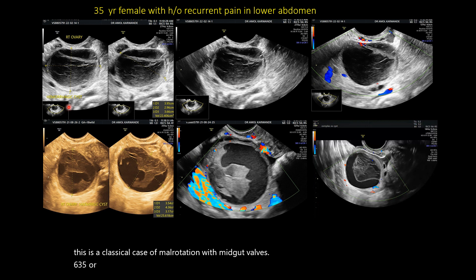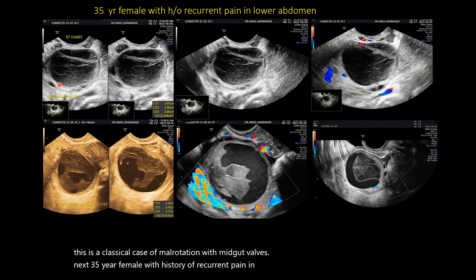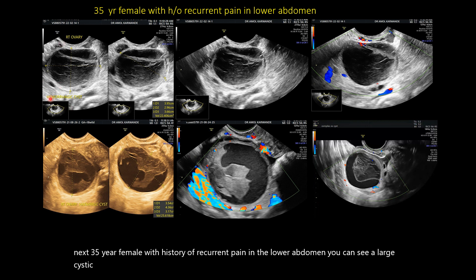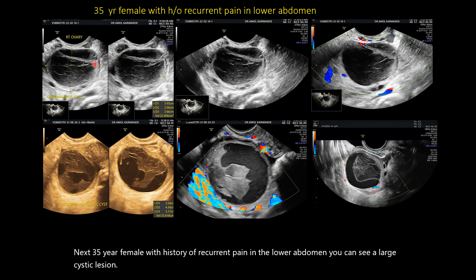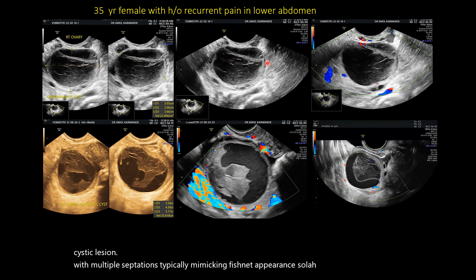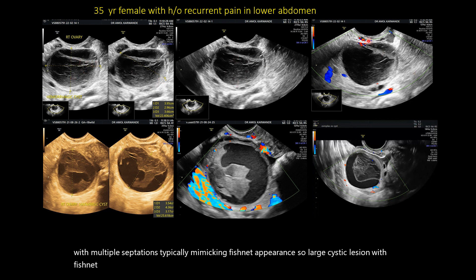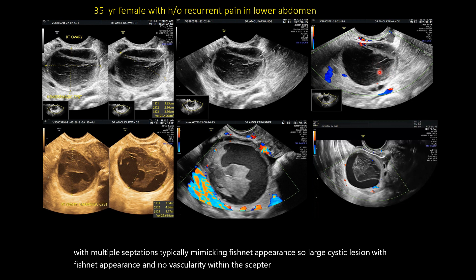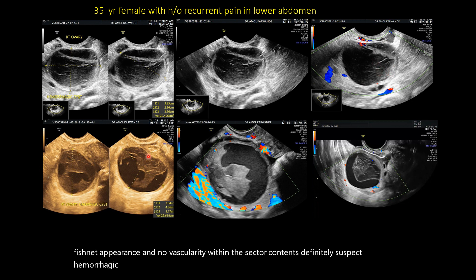35-year female with issue of recurrent pain in the lower abdomen. You can see a large cystic lesion with multiple septations, typically mimicking a fishnet appearance. A large cystic lesion with fishnet appearance and no vascularity within the septal contents definitely suggests hemorrhagic cysts.